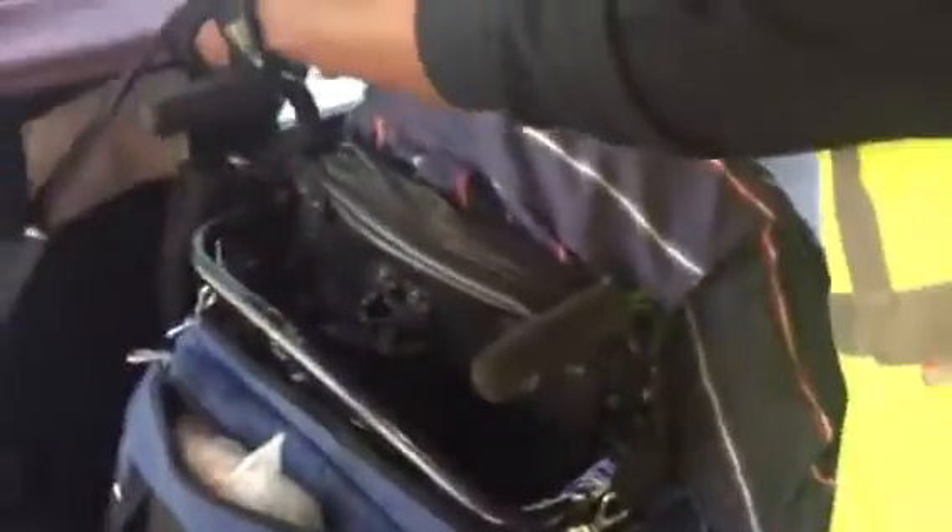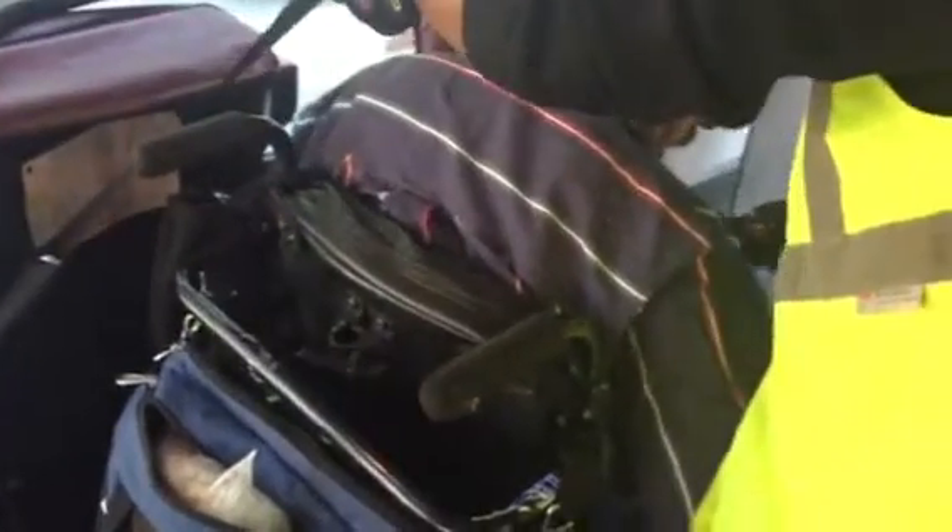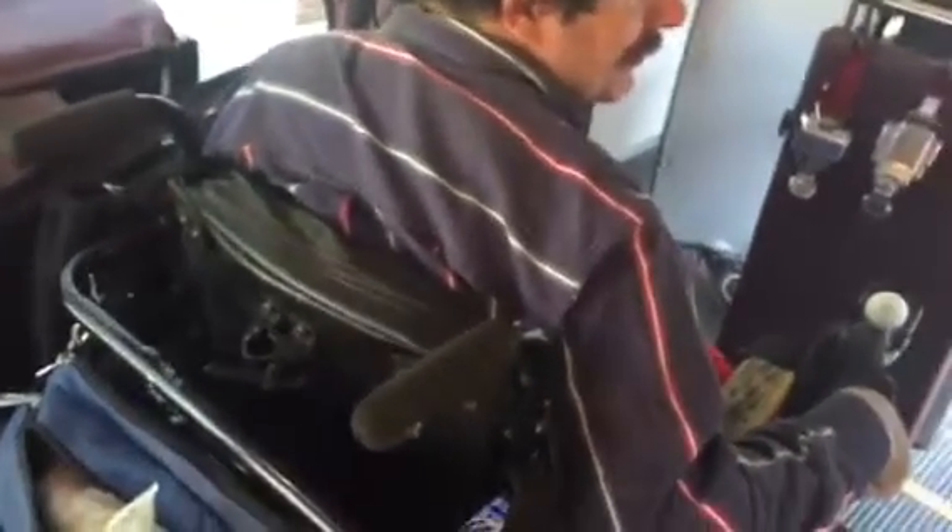Time for the lap belt assembly. She's got them on, both hooked up to the back bottom straps on the rear. She's coming across the shoulders now. She's got her strap in and she's tightening down her strap.